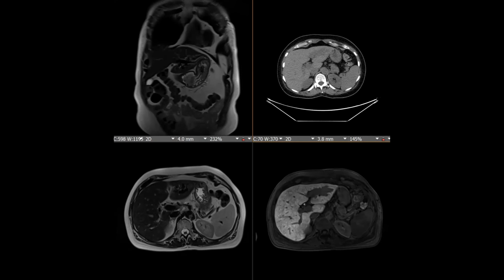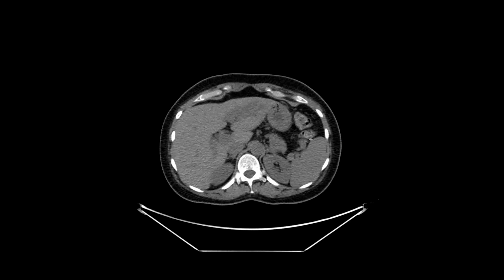So this was a recent case. A woman in her 60s presented to us for follow-up of an abnormal finding on a recent PET examination. She had had approximately 14 prior PET CT examinations for follow-up of breast cancer, and recently they'd all been negative.